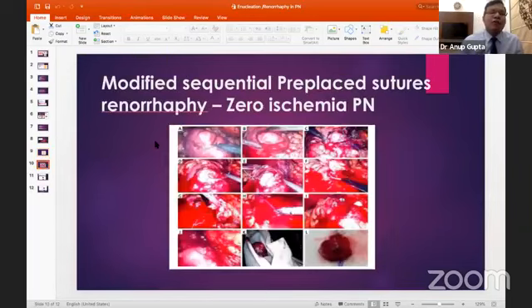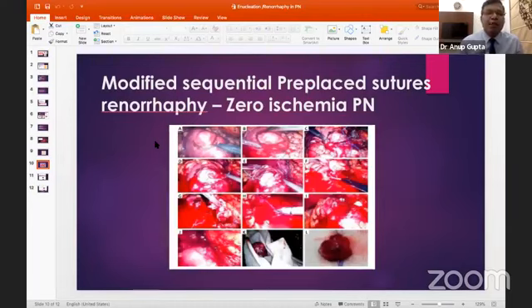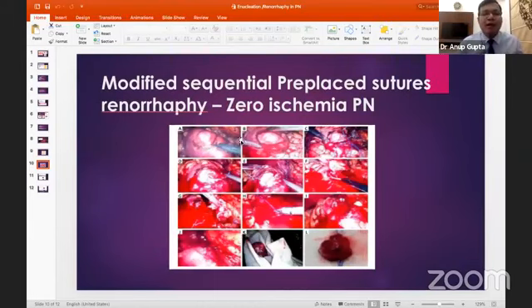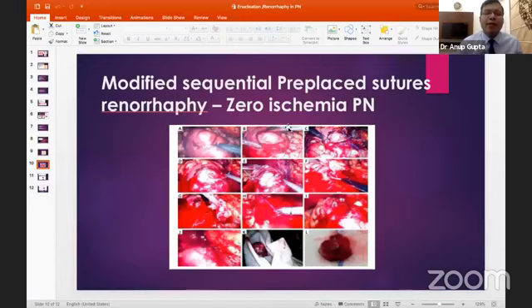Another described method is the modified sequential pre-placed suture technique, which allows for zero-ischemia partial nephrectomy — no clamping of vessels is required. This can be done only for small T1a cortical tumors. Two or three pre-placed sutures are placed to the depth of the kidney below the base of the tumor, then the tumor is cut and the sutures are tied.